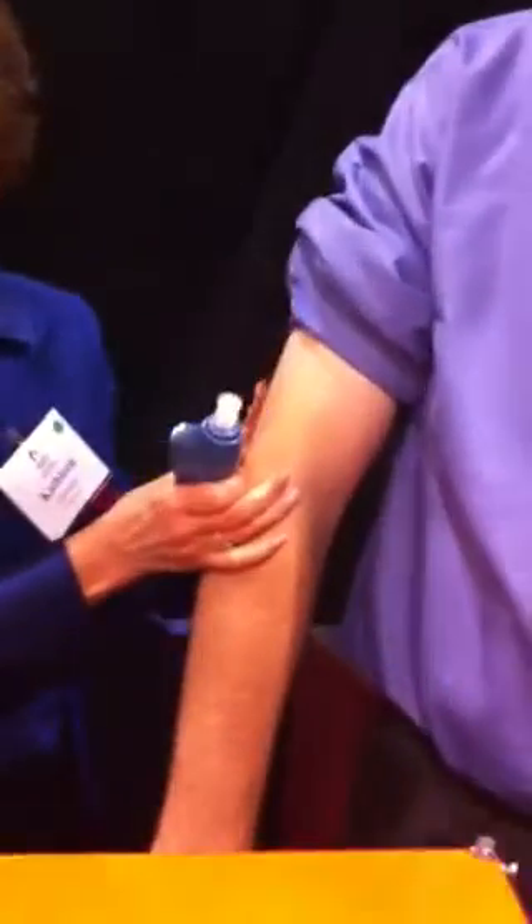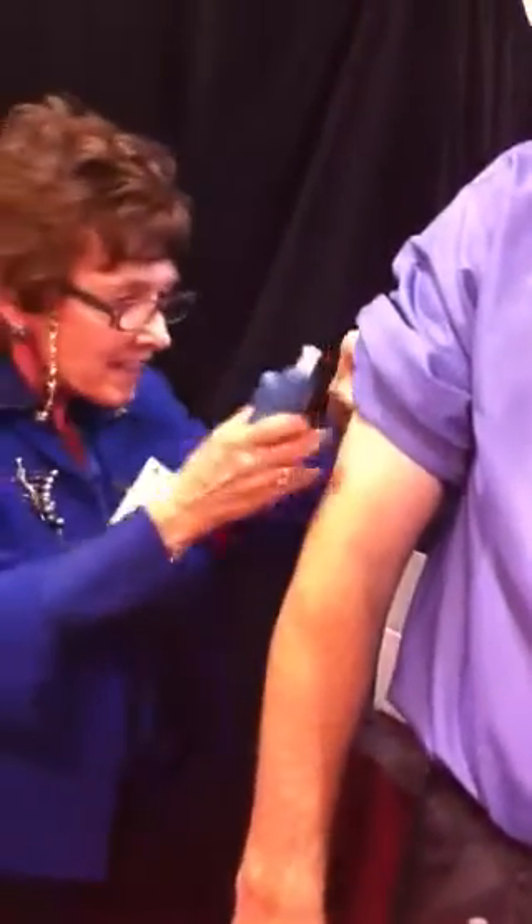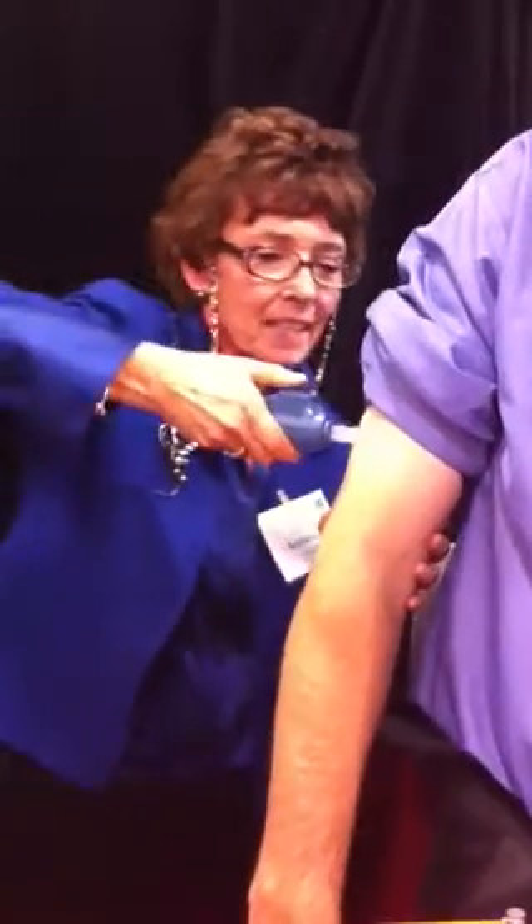It looks like it would fit nicely into a suitcase. So that just took a dosage right there. I just want to relax. Ta-da!